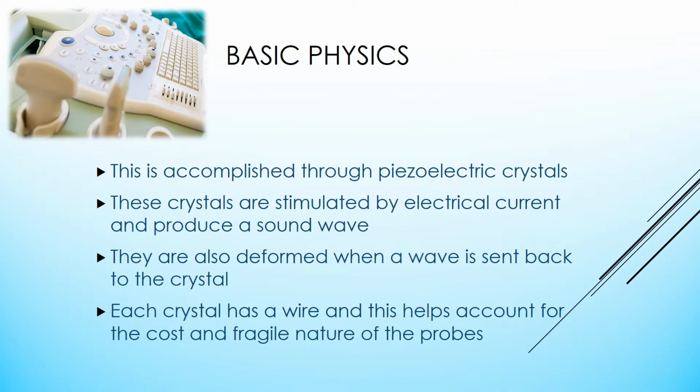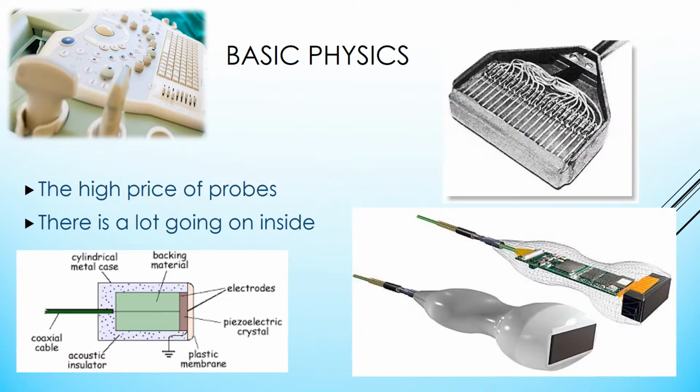This is accomplished through piezoelectric crystals. These crystals are stimulated by electrical current and produce a sound wave. They are also deformed when the wave is sent back to the crystal. Each crystal has a wire, and this helps account for the high cost and fragile nature of ultrasound probes. This slide is going to sum up the high price of probes. There is a lot going on inside these guys.